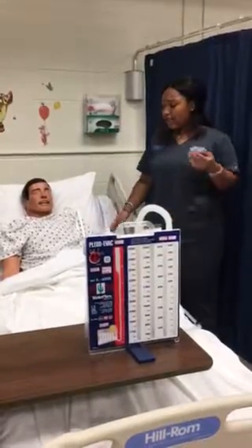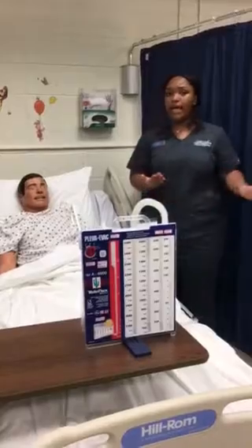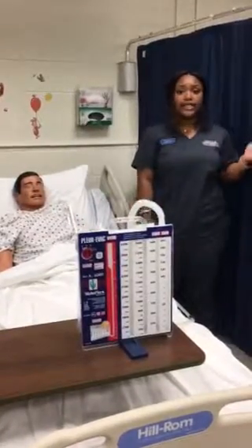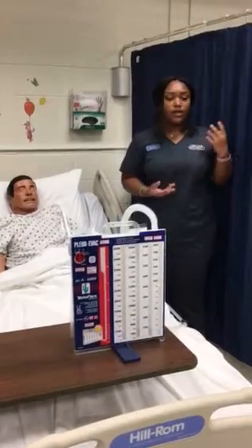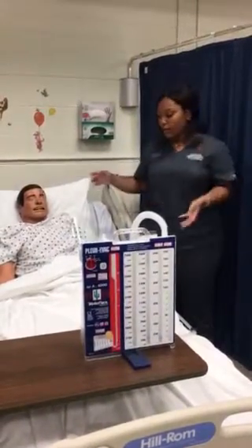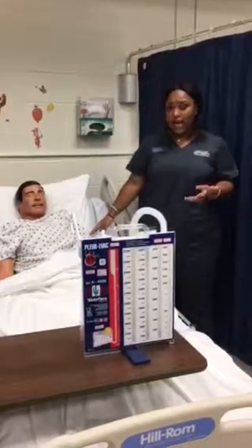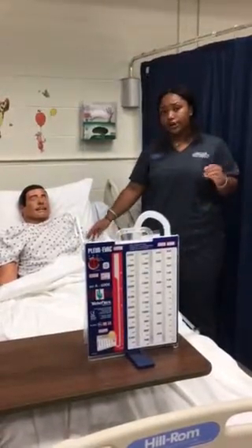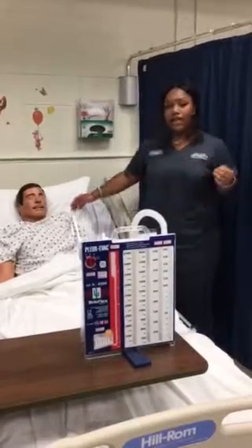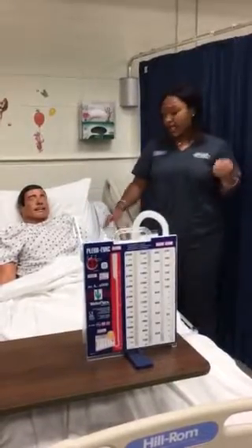So basically, if a patient is getting a chest tube, they typically have experienced crepitus, a pneumothorax, hemothorax, empyema, pleural effusion, things like that. So once all of that is understood, I will go on to assess the patient's heart rate, respiratory rate, their basic vitals, as well as how they feel laying in the bed, their position, and etc.